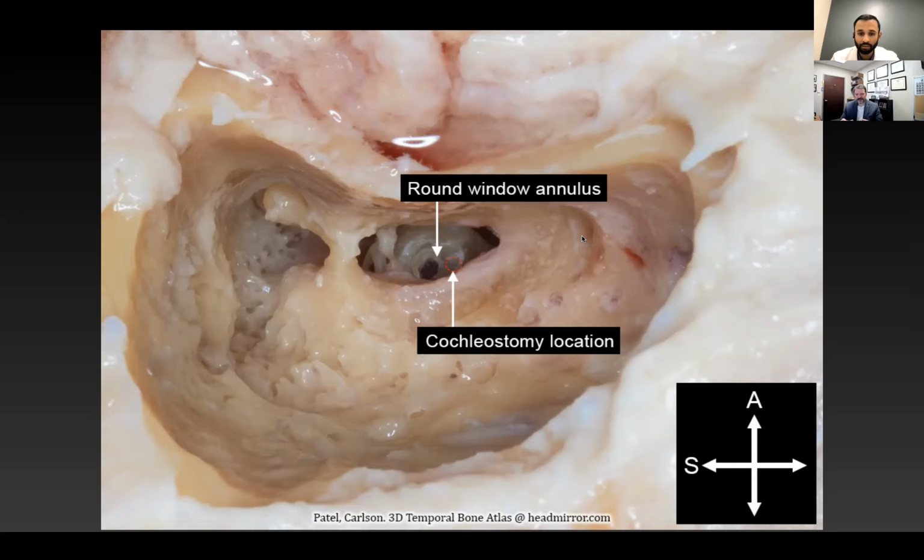Before you start opening it, there's something called preparing the facial recess that's often not talked about in textbooks or anatomy dissection atlases, but it's the idea that you want to set yourself up well. You make sure your bony ear canal is thinned well without going through it, but you're down to that bone plate, and you make sure the bone over the facial nerve is lowered to an appropriate level, almost all on one plane.